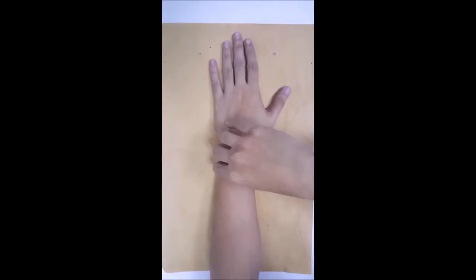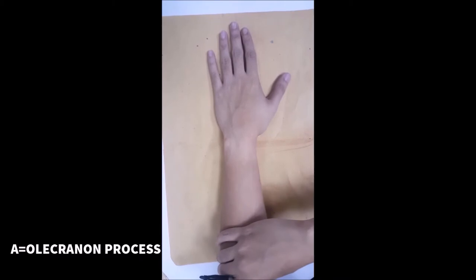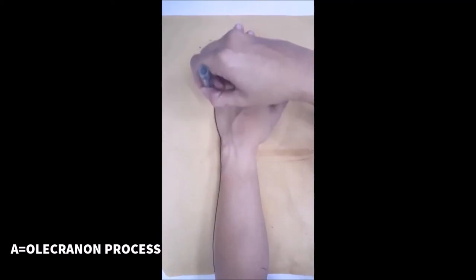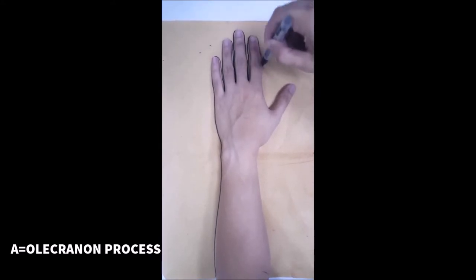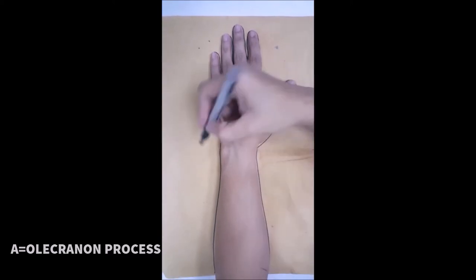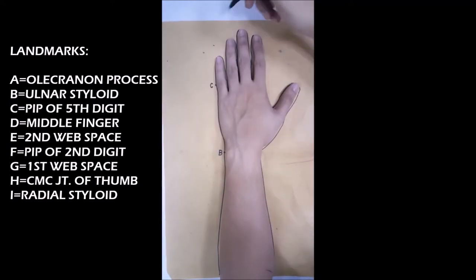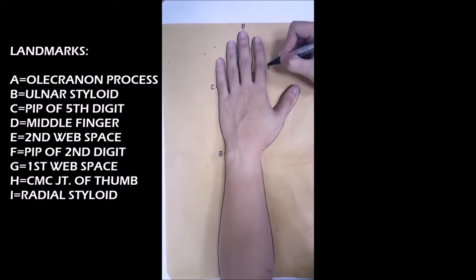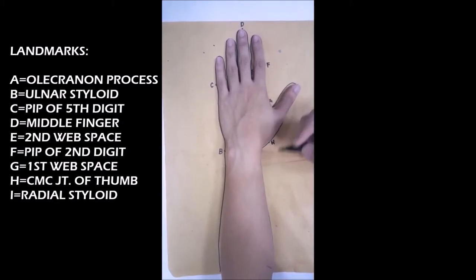Pattern making: Place the person's hand flat down on a paper towel and mark A for the olecranon process of the elbow. Then trace the outline of the upper extremity from one side of the elbow to the other. Then mark B for ulnar styloid, C for the PIP of the fifth digit, D for the middle finger, E for the second webspace, F for the PIP of the second digit, G for the first webspace, H for the CMC joint of the thumb, I for radial styloid.